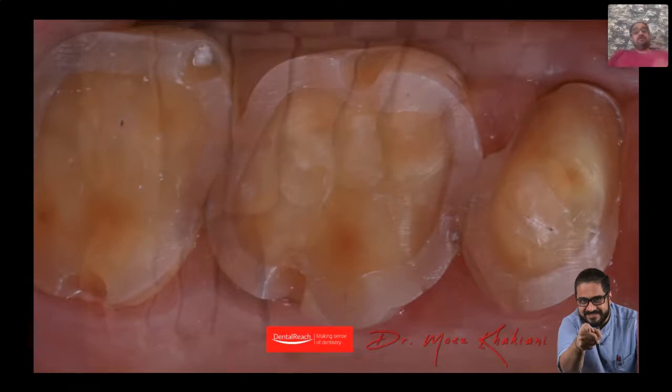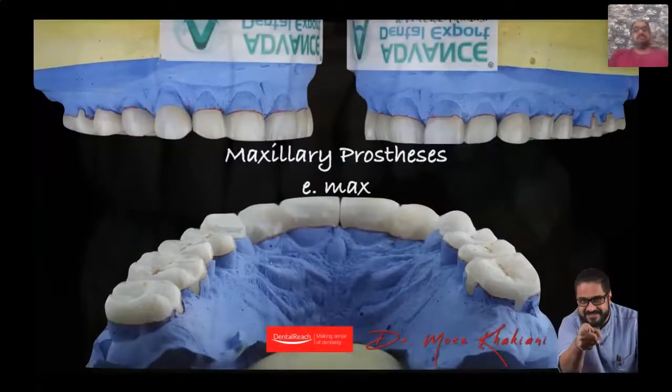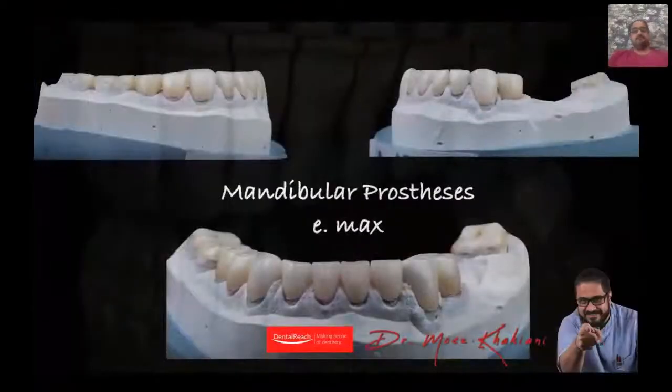This will make sure that I get my positioning of the veneers perfect. Labially, there are veneers. Occlusally, also there are veneers. This is what I get back from the laboratory. Partial restorations. Okay, look at the molars. You can see those small extensions into the grooves that I have made there. This is how it looks for the mandibular arch.